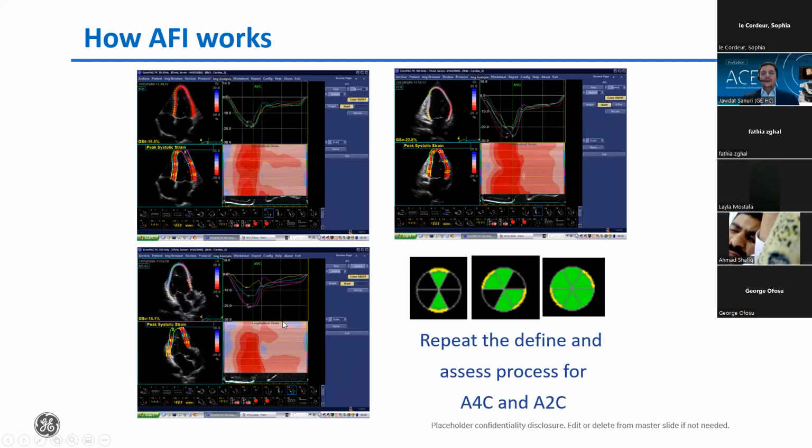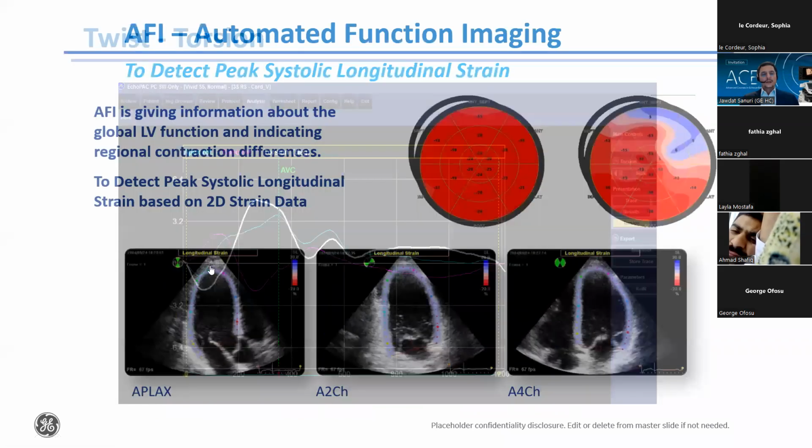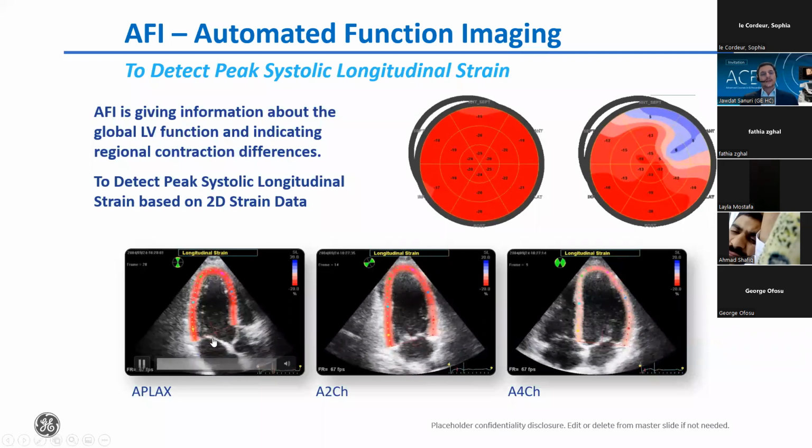tracking. However, it is very critical that we have the right apex. It's an open apex. If you are playing this 4-chamber and you see huge excursion, for example, of the apex, that means you are foreshortened.